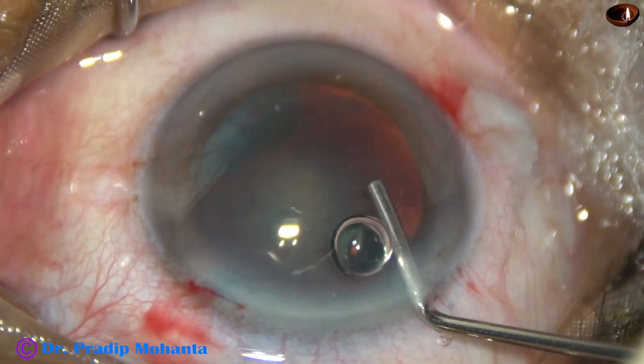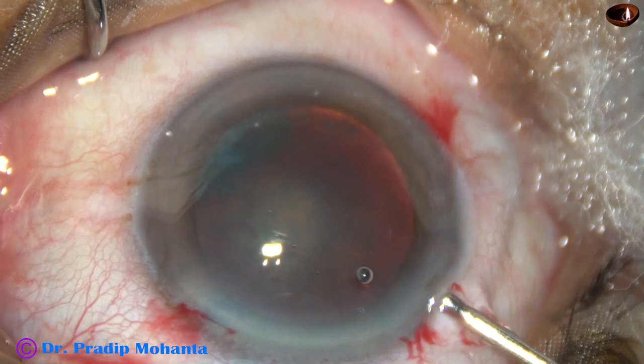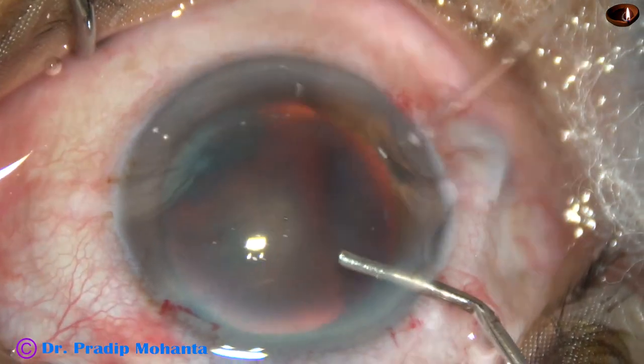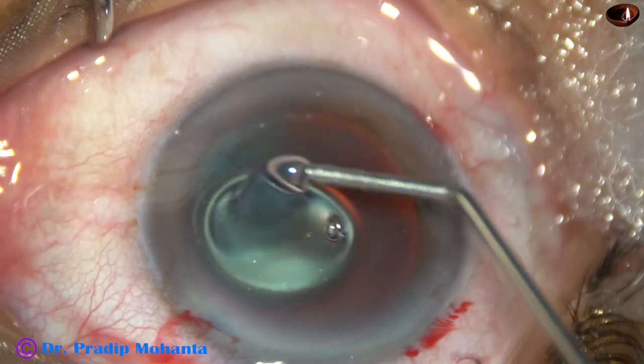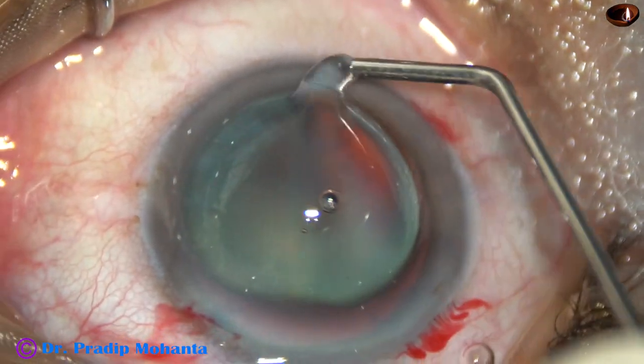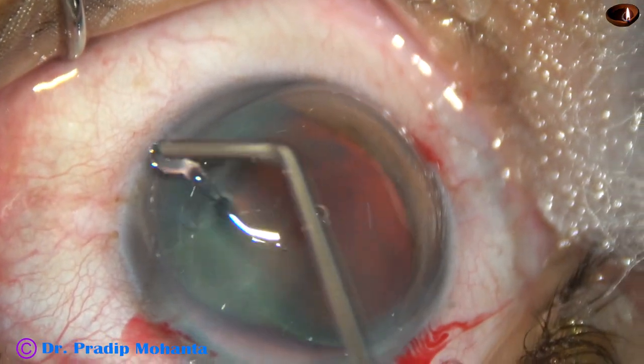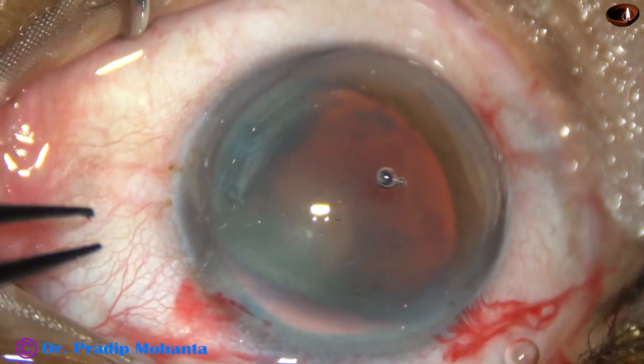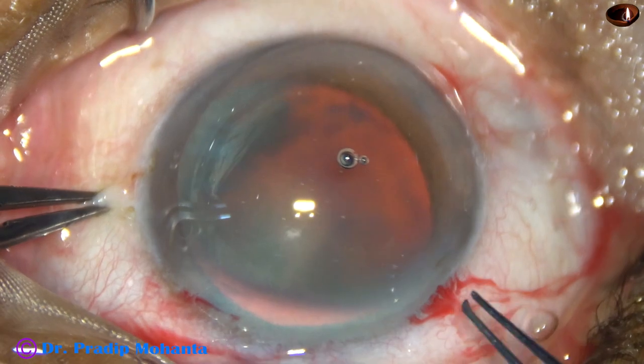By this time, all the incisions have been made. The capsule has been stained with trypan blue dye. And now the anterior chamber is being filled up with 2% hydroxypropyl methyl cellulose. The methyl cellulose is also applied over the corneal epithelium — it improves visibility and it also protects the corneal epithelium.